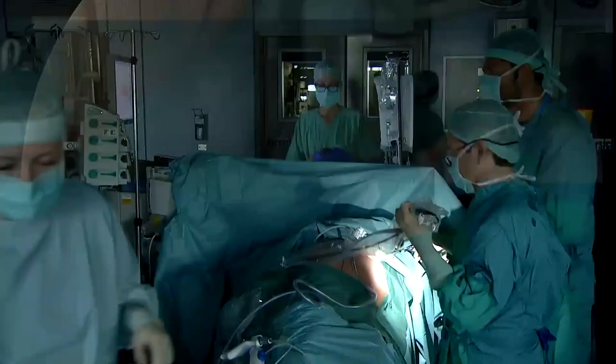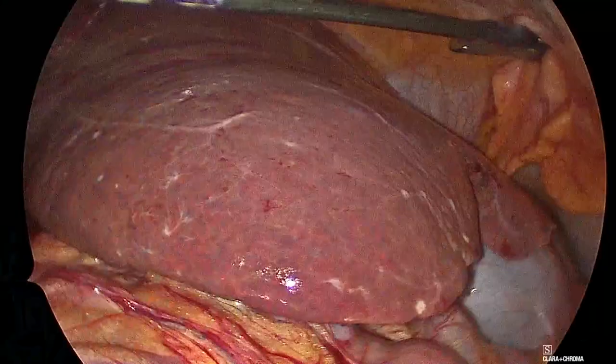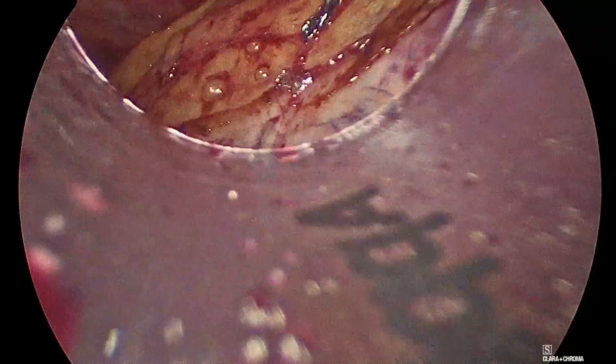So we will open now. We want to check that the liver is fine. Okay, good. So liver is fine, under control. We come out, good. No bleeding. Fine. Okay, so now we mark, this is the kidney, okay?